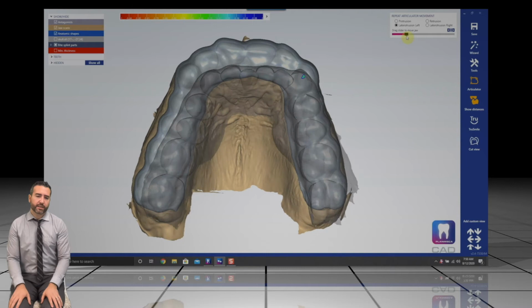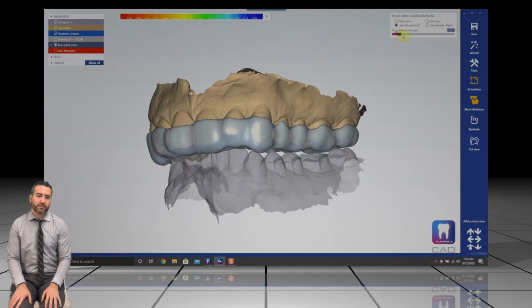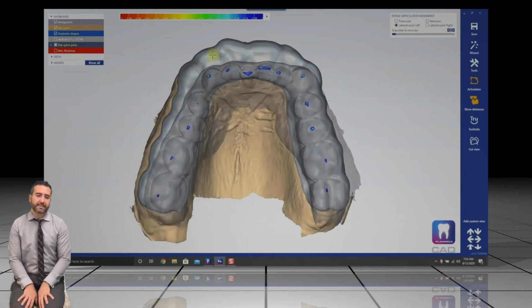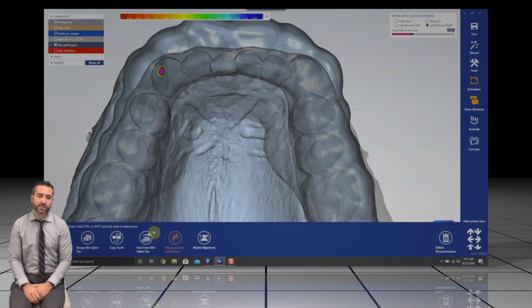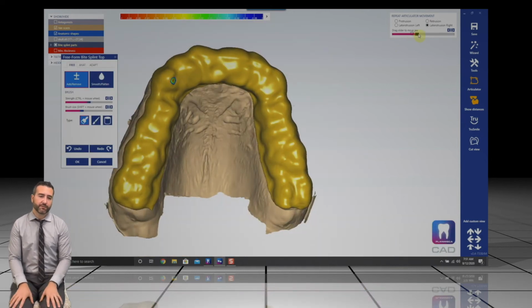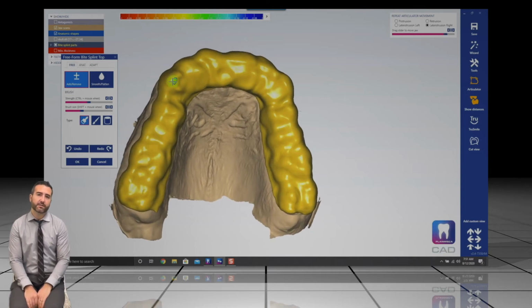And so here we could work out the lateral movements and anterior guidance here. This is just a standard full arch permissive splint where we have anterior guidance and posterior disclusion. But like I said, you could get more fancy with your appliances. And there's even ways to do sleep appliances if you want to be creative, but you just have to be careful there that everything's worked out with insurance, because typically you have to be from an approved center to be able to do in-house sleep appliances.